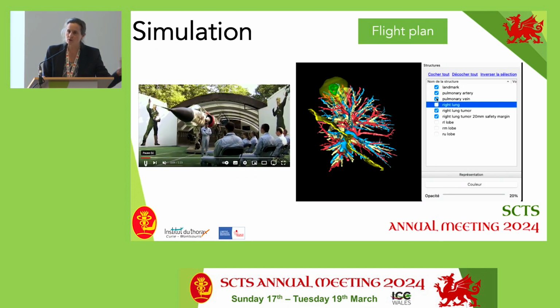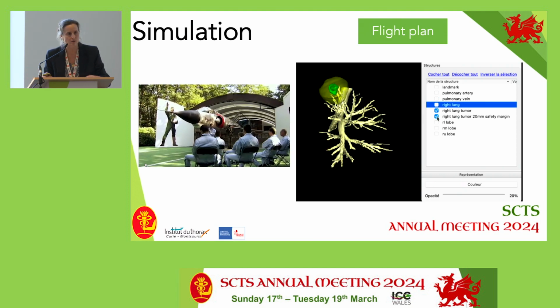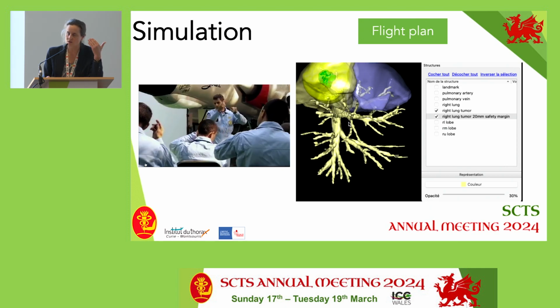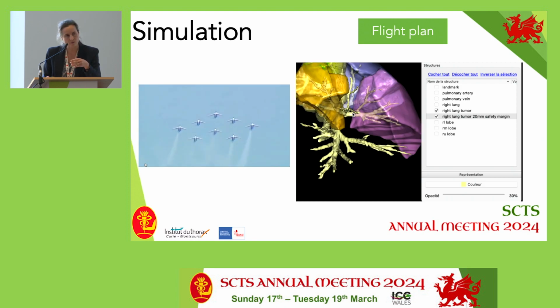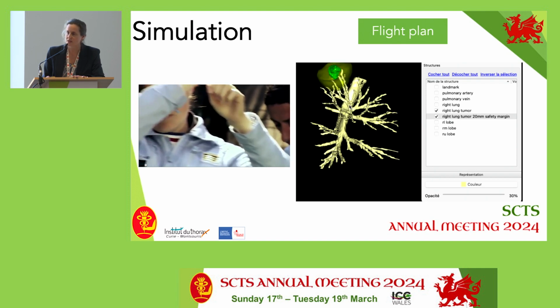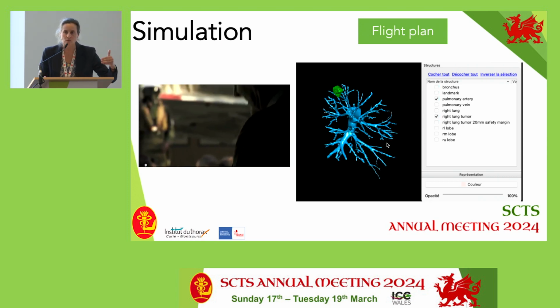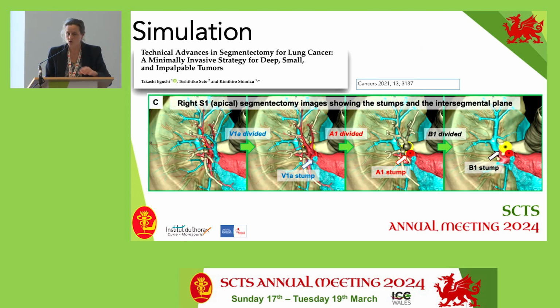And as for pilots, we usually do a lot of comparison between surgery and trying to take care of a plane. I think we also have to think about simulations and have a flight plan in our head. And what are the pilots doing before their flight? I think I asked the residents to do the same. For example, we are planning a S1 plus S2 segment, and he has to tell me, okay, first A2, second B2, and the way in which he will treat each vessel.